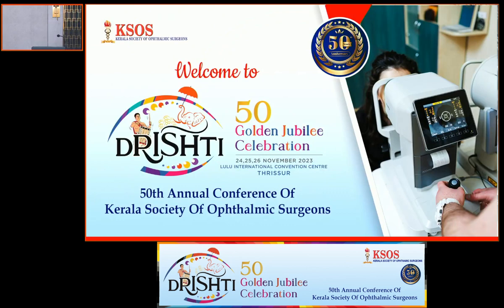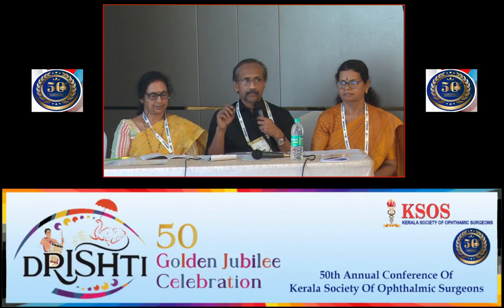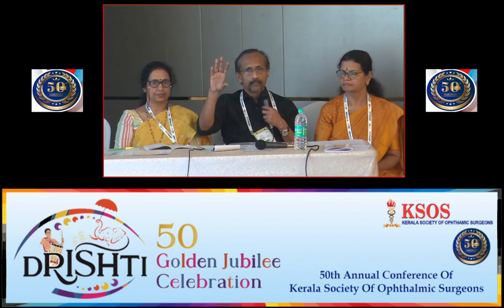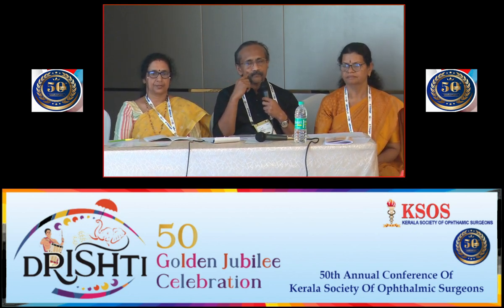Very nice, Dr. Dalia. Even though we all practice soft contact lens fitting, there are a lot of small things which are very relevant. As she rightly said, the lens should be centered well, moving a little when you blink. You should also observe under the slit lamp whether any blood vessels at the limbus are being pinched by the contact lens. Then you check the visual acuity for distance. Ask the patient to blink, and see whether the vision remains stable during and after the blink. If it is not stable after the blink, the lens is loose.